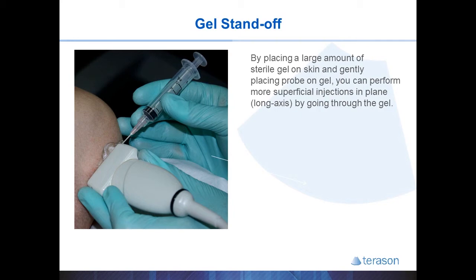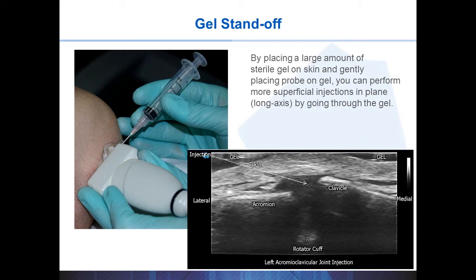With a gel standoff, you usually place a large amount of sterile gel under one end of the probe and carefully rest the probe on the gel, making certain you don't displace the gel all the way. If you have your target image, you can begin placing your needle into the gel and will see the needle on the screen before it actually enters the skin. You can adjust your trajectory prior to puncture and advance through the gel into the skin and towards your target, as detailed in this AC joint example.